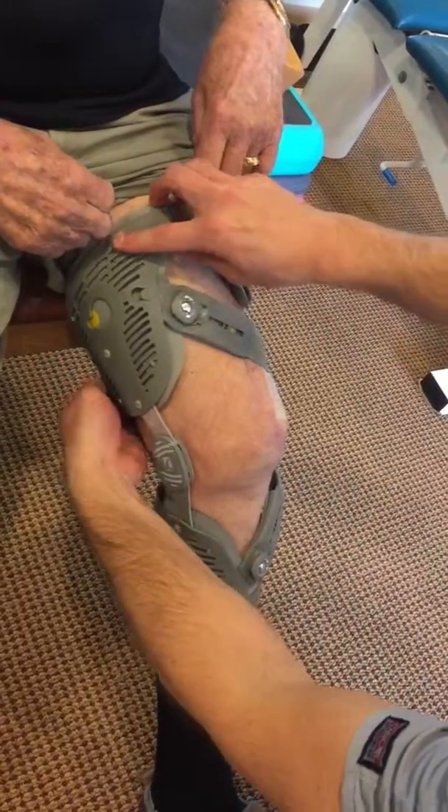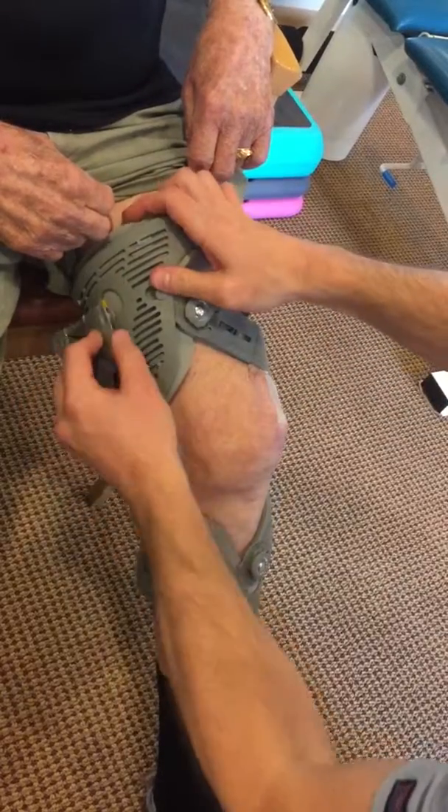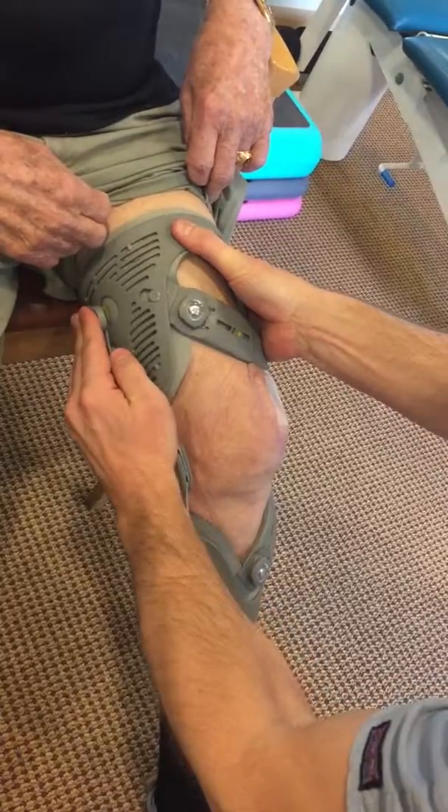At that point, I will move to the top. I'm going to grab the yellow circle to the yellow hole. We are going to snap it in, and then we are going to snap it closed — and you will hear a distinct snap.